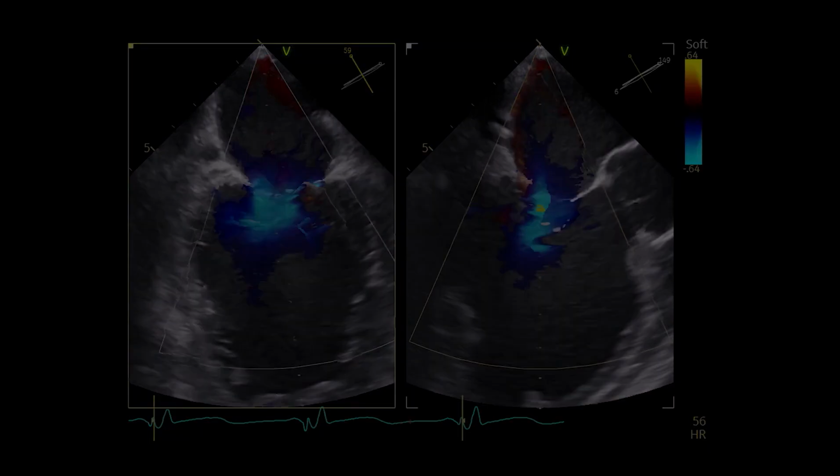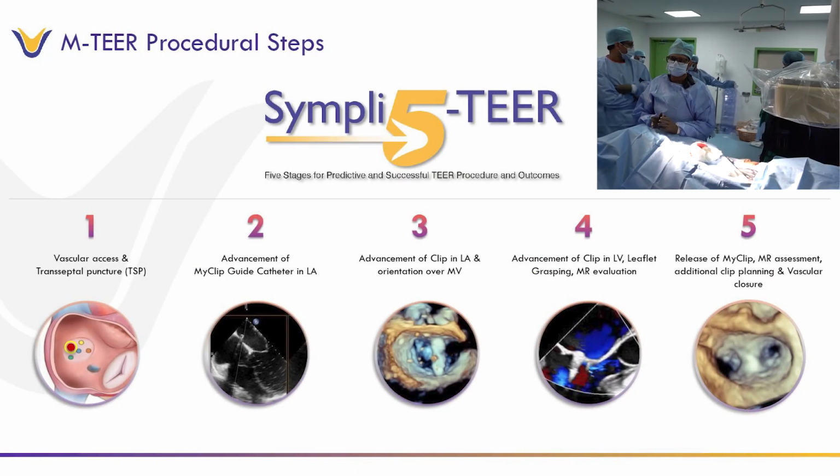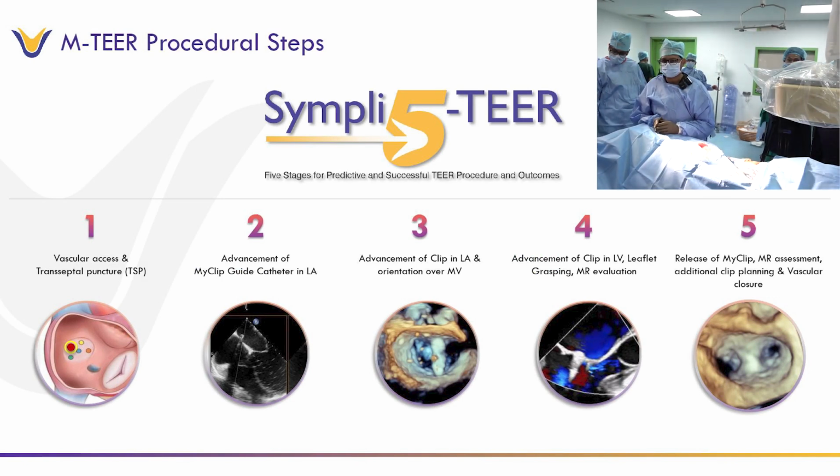Now over to Dr. Gautam. This is a clear-cut case of FMR with an A2P2 gap, and the MR jet is basically exiting from the A2P2. So now we will plan the case. I will describe the basic steps of this case, and we will go step by step.